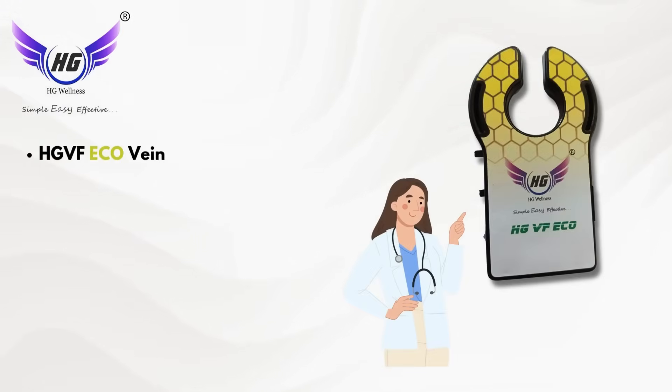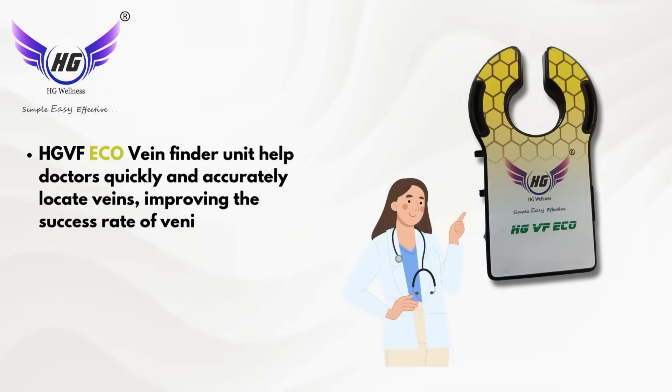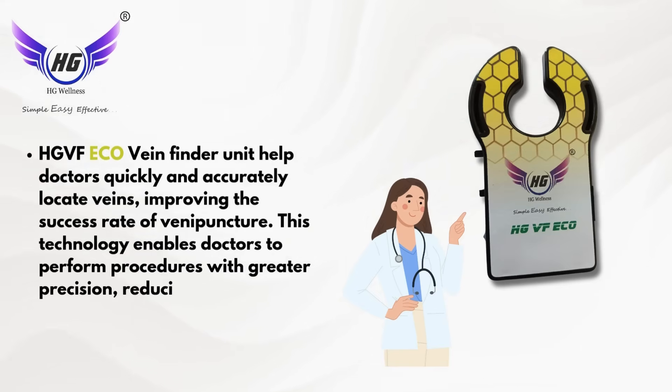HG VF ECO Vein Finder units help doctors quickly and accurately locate veins, improving the success rate of venipuncture. This technology enables doctors to perform procedures with greater precision, reducing patient discomfort.